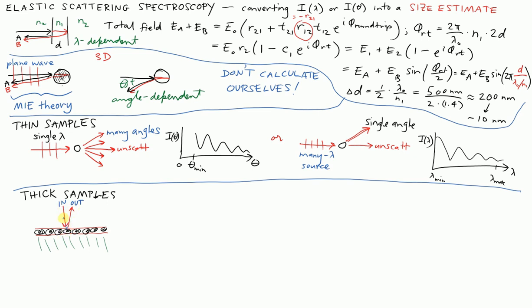And then in blue, what I'm going to suggest is that light might come in, hit this cell, scatter off again, off of something, go over here, scatter off of something. Maybe it comes back to really close to where it came in, and then that light might happen to scatter out in the exact same direction. So again, we've got two ensembles of light to think about. The single scatter and this multiple scatter.